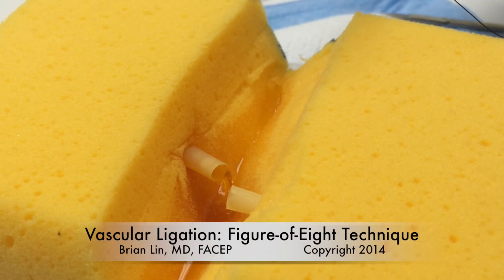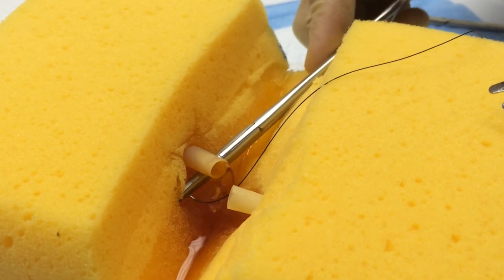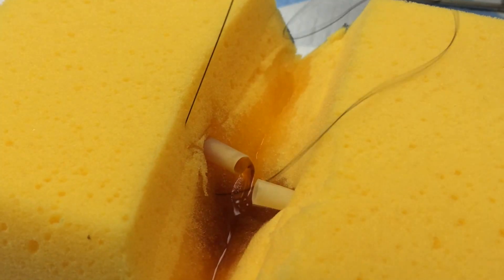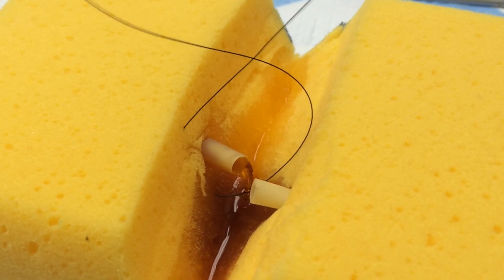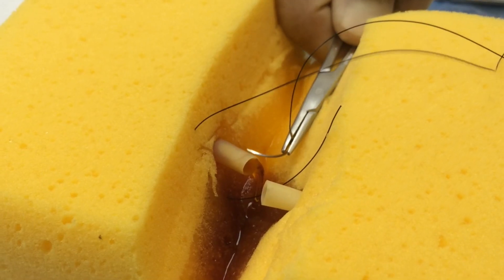This video is a demonstration of a vascular ligation technique using a figure of 8 suture. Your first throw will go deep to superficial on one side of that bleeding blood vessel. Typically with this technique you're going to be throwing your suture in plane with where you see the bleeding coming from the vessel.